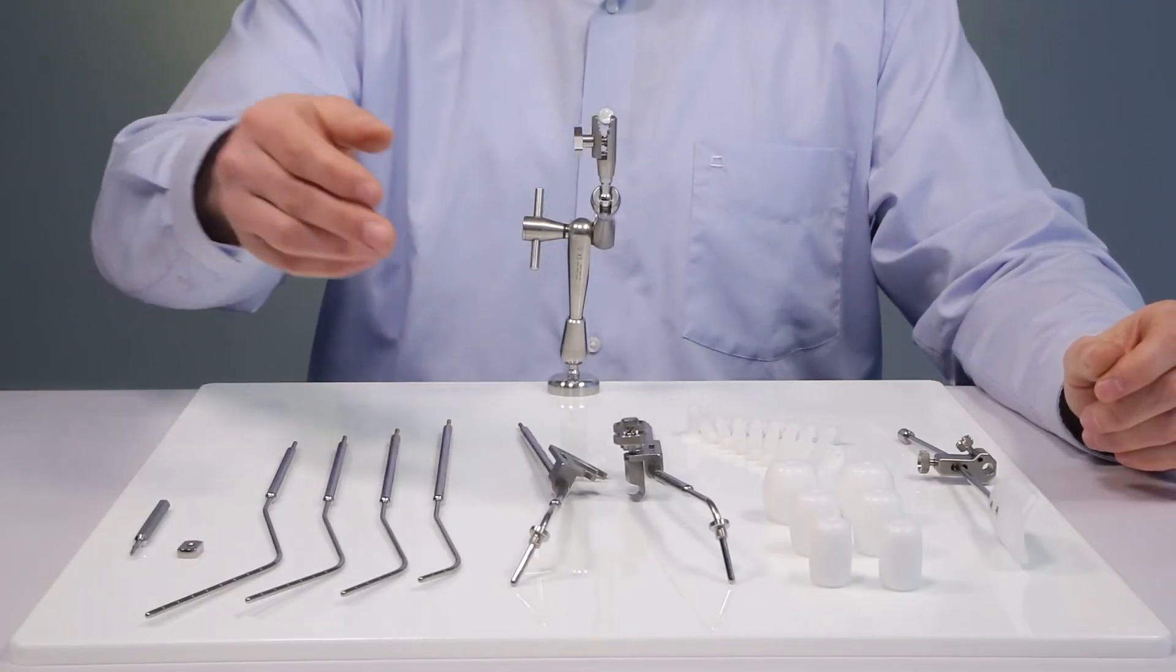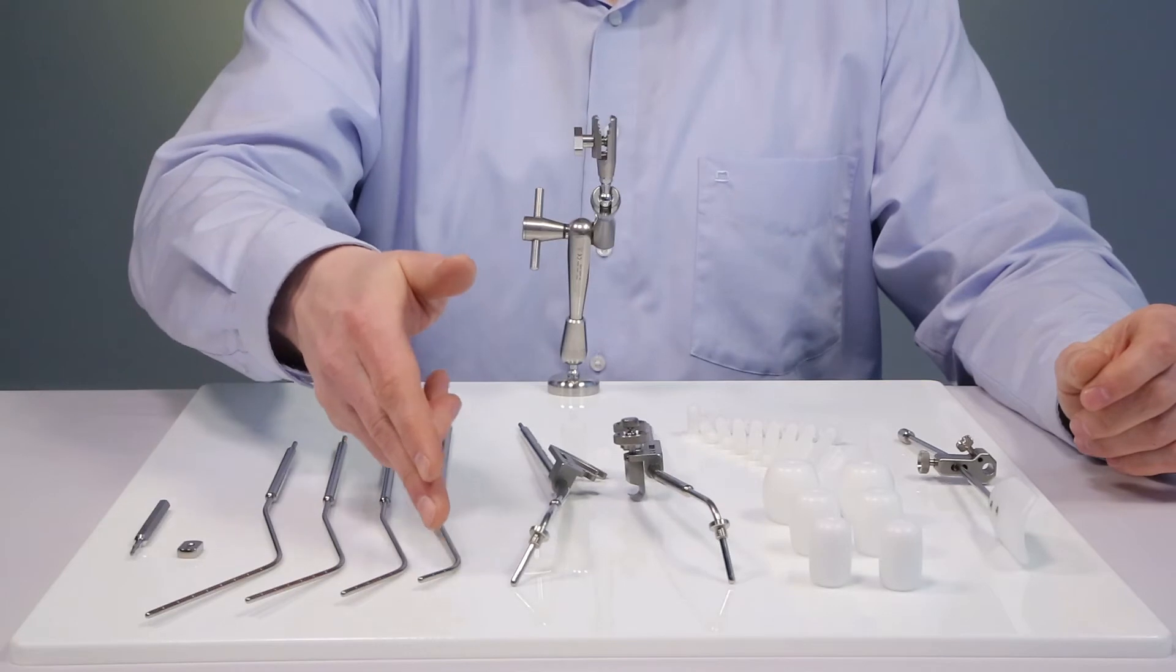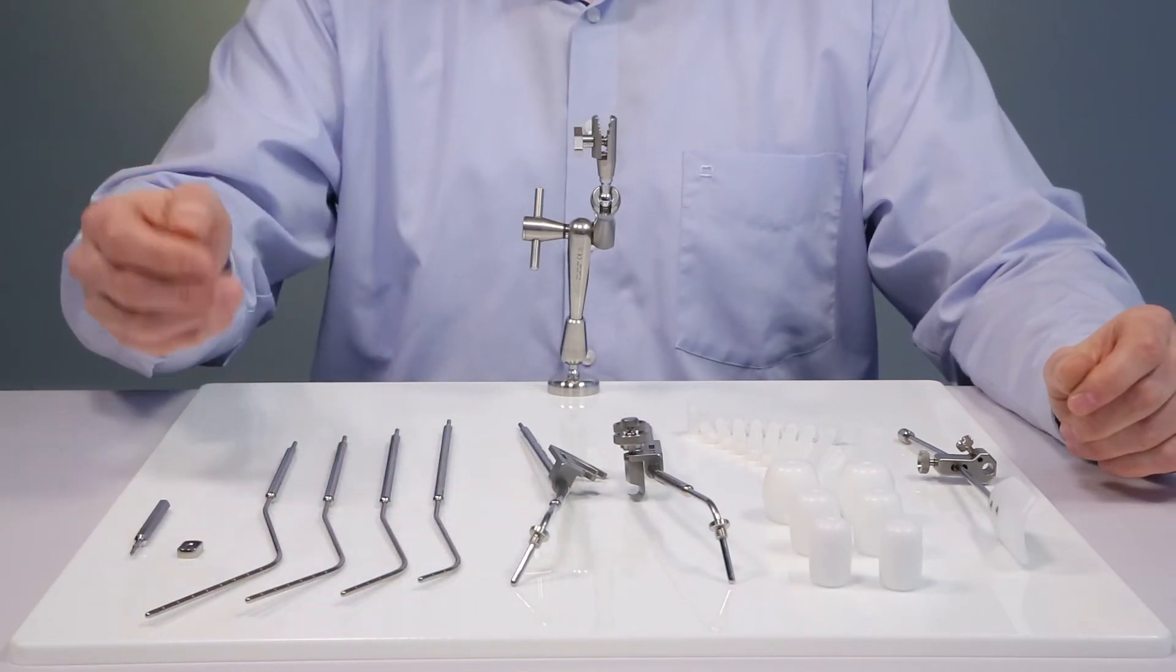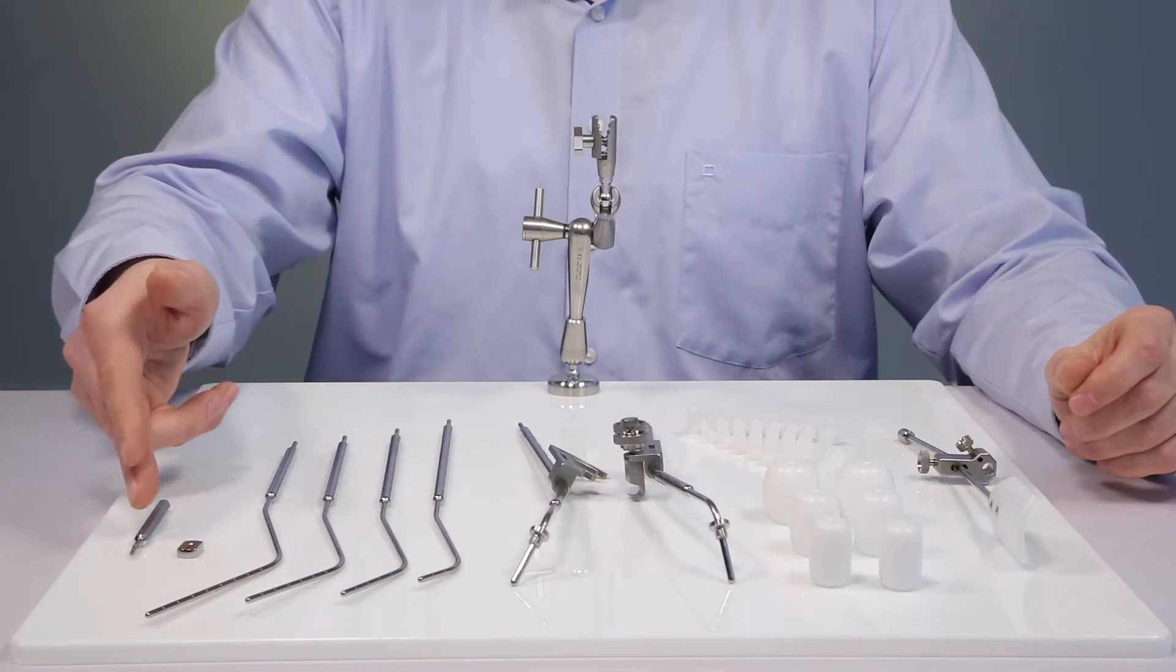The set consists of four intrauterine tubes in 2, 4, 6 and 8 centimeter length, a cervical stop and a corresponding Allen wrench.